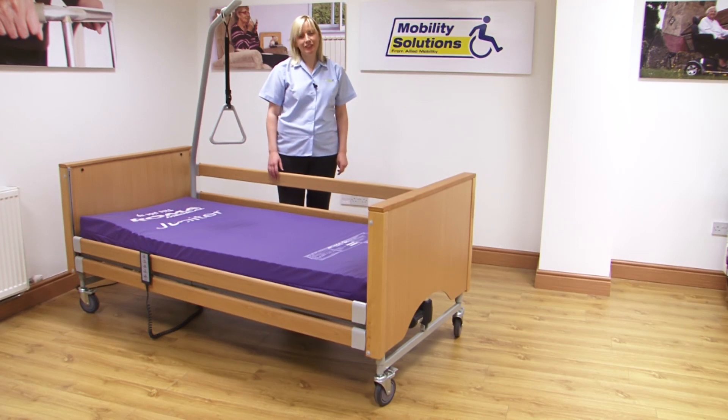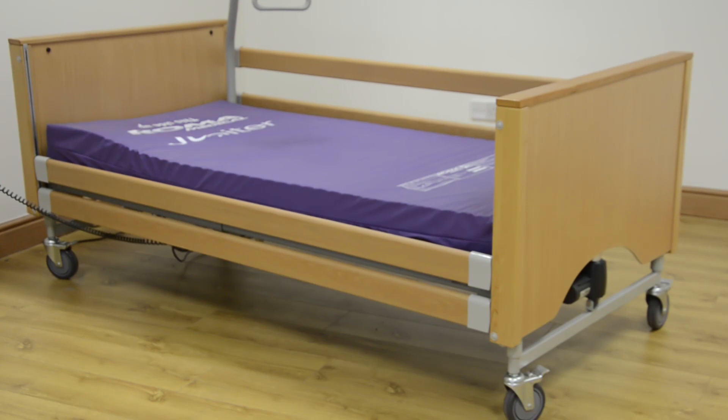Hi, I'm Sarah from Mobility Solutions. Today we're going to look at the Siesta Home Care Bed from Roma Medical.